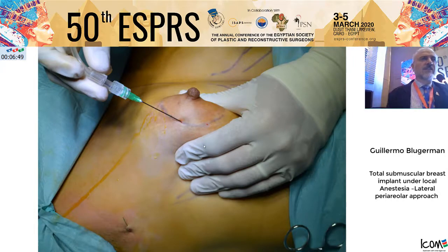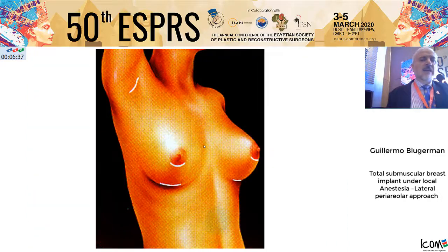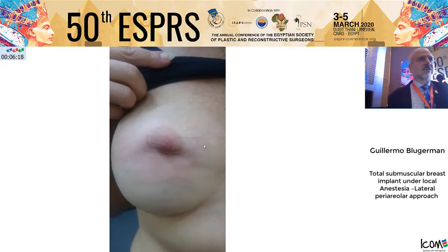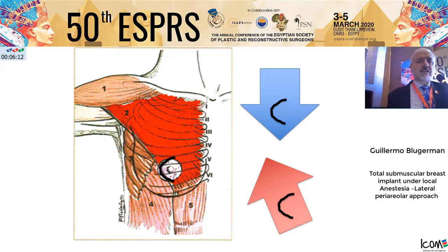Another infiltration with the rest of the solution is done in the lateral area and in the skin and glandular tissue, reinforced in the lower border of the pocket. We changed from the inferior periareolar because it crosses the gravitational forces and the contraction of the pectoralis, sometimes causing retraction. The lateral periareolar is exactly in the same line of gravity and muscle contraction.